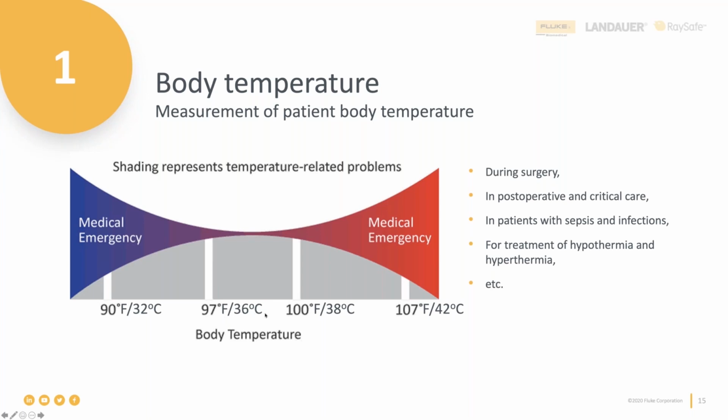Unlike Fahrenheit, the Celsius scale is a lot more condensed. So the normal body temperature, let's say, is 37 or 36.6 degrees Celsius, whereas 2 degrees more or 2 degrees less already takes it closer to an extreme, which is why we would not recommend agreeing with that sort of error and would recommend a more accurate device for body temperature measurement.